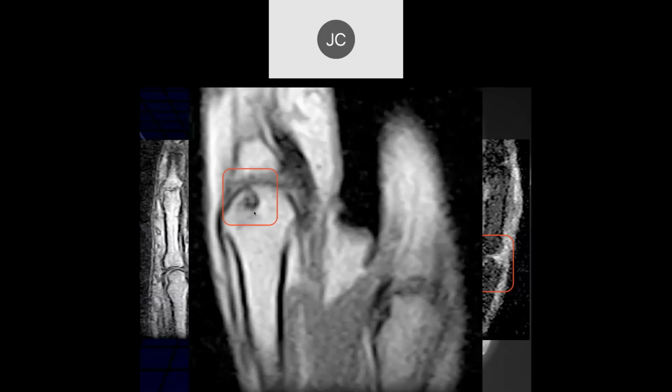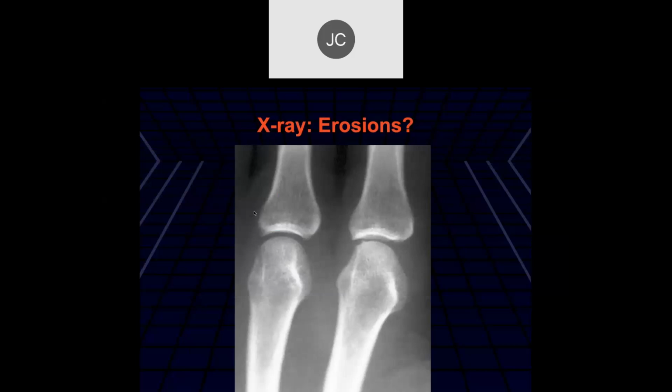I'm thinking what lawyers would say after they take the X-ray, which is pretty normal, and then the MRI, which is abnormal. They'll say the MRI caused it. It's known as post hoc ergo propter hoc. After this, therefore, because of this. Now, what they really say is, oh, the MR can see it much better. We'll make sure we get MR on all of our clients so that we can maximize the amount of pathology we pick up for the settlement.